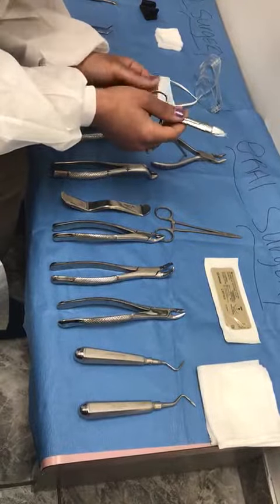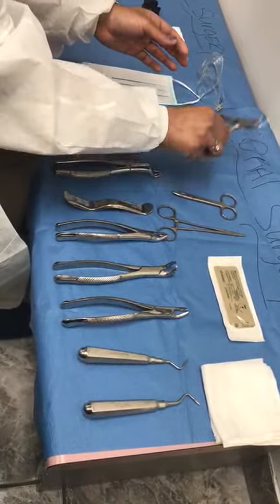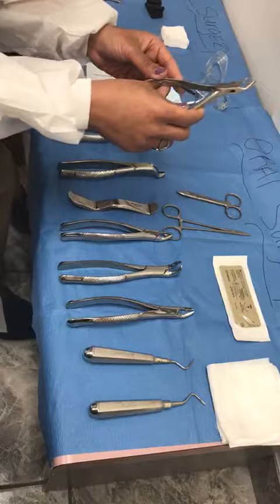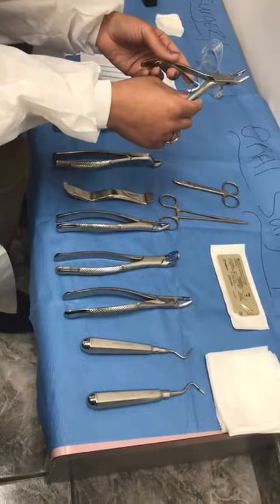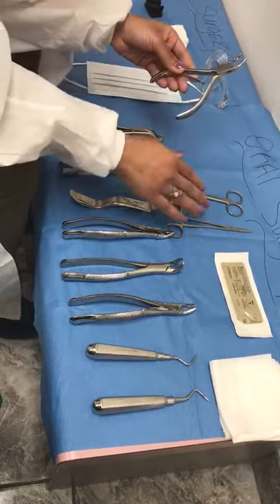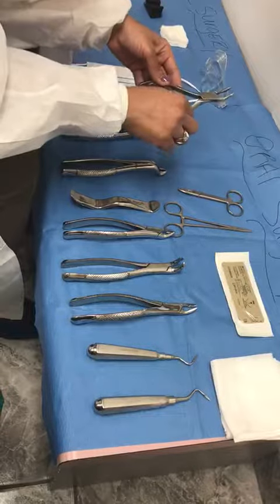This actually is a rongeur. A rongeur is used during extraction — after the tooth has been extracted, you might have extra tissue to remove or even a piece of bone sitting there that you need to get out. You would use this rongeur, or sometimes a hemostat — it's optional and depends on the doctor. You can do both functions with either.